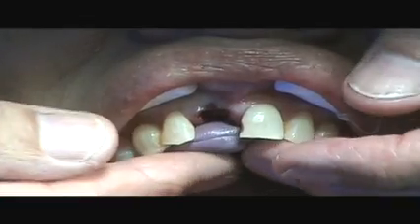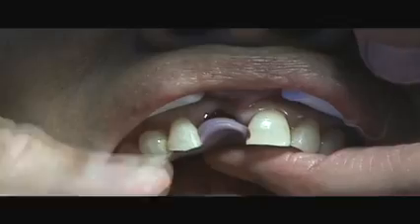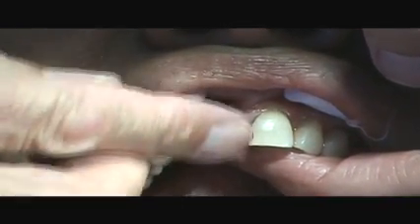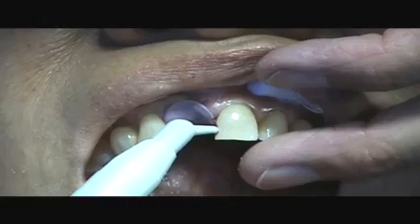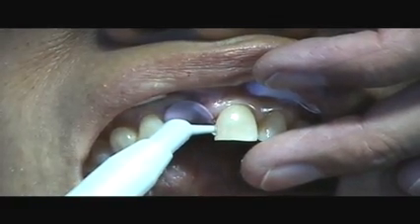The putty impression material is mixed and placed over the extraction site, firmly molding it to the linguals of the maxillary anteriors and drawing the soft material to the labial through the edentulous area. The composite is placed from tooth number 9 over the stent to tooth number 7.